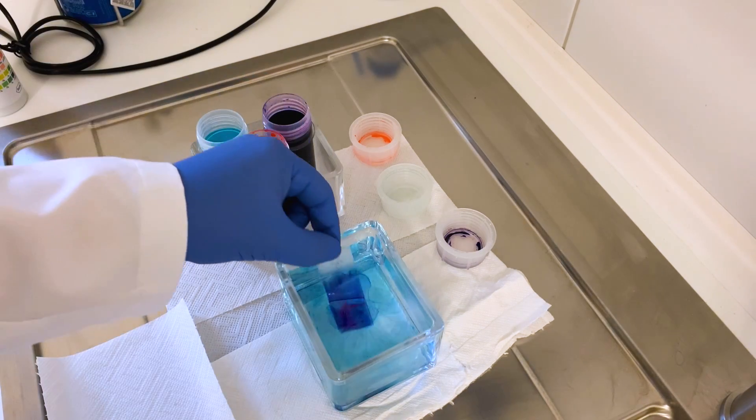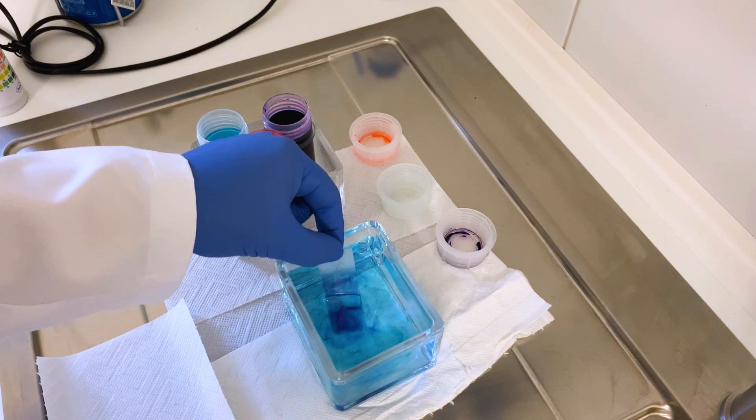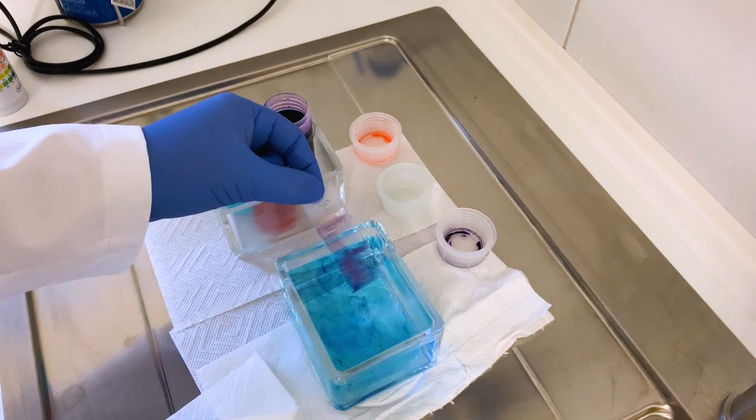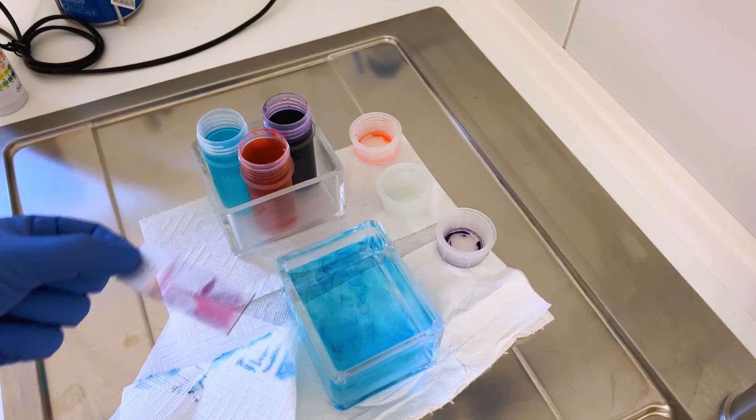After staining any excessive color has to be washed off. I'm using distilled water here. And the last step would be to wipe the water and the color from the downside of the slide before putting it again on the heating plate for drying.